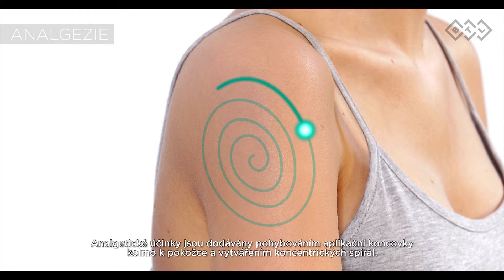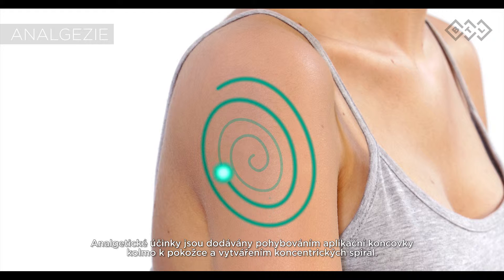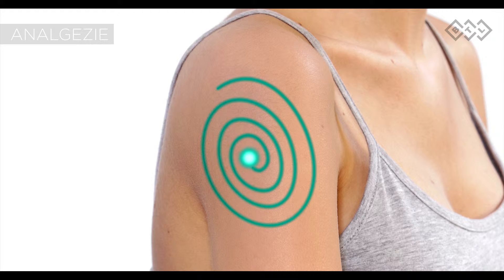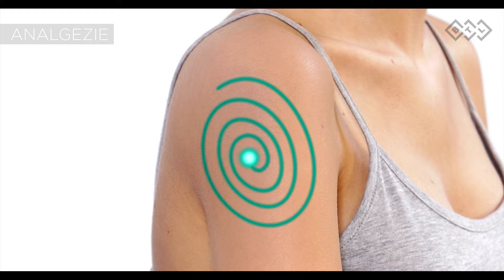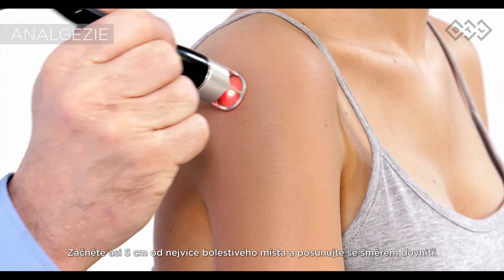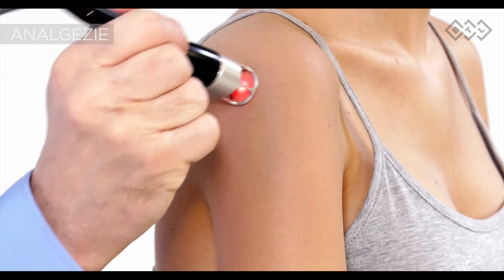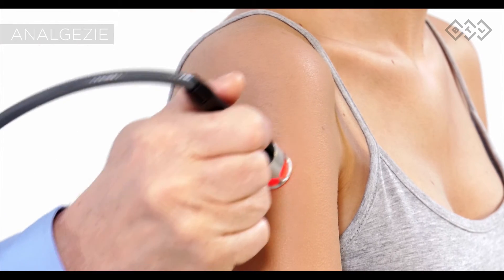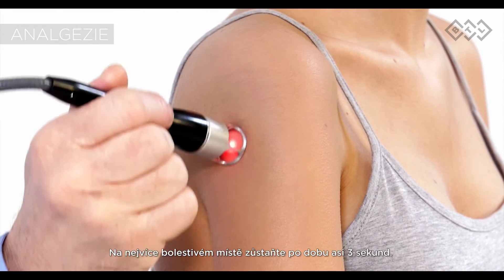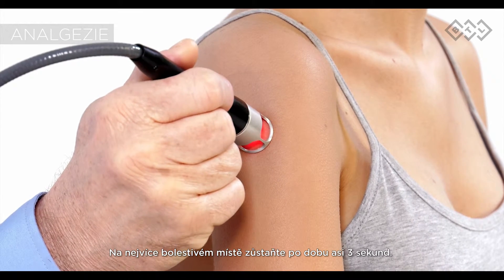Analgesic therapy is delivered by moving the applicator perpendicularly along the skin surface and creating a concentric spiral. Start about 5cm from the most painful spot and move inwards. Rest above the most painful spot for about 3 seconds.